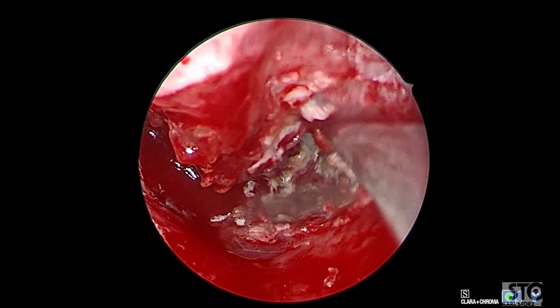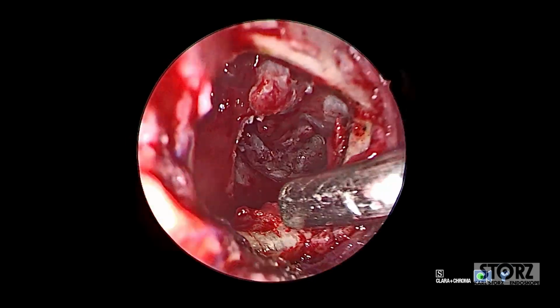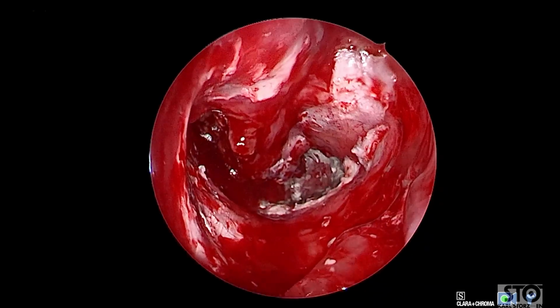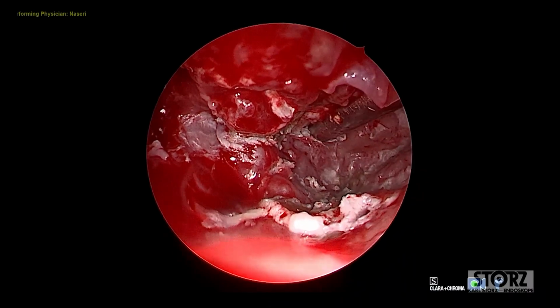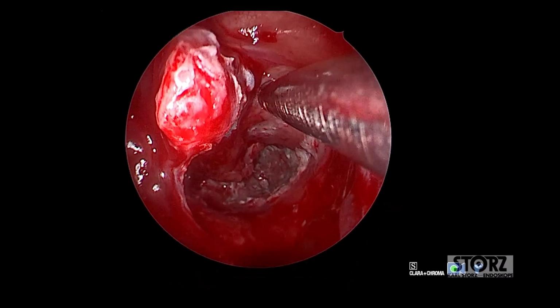With this modified brow incision and the osteotomy, it allows us to avoid use of a bifrontal bicoronal incision and allowed us to save approximately an hour of time. Total case duration was approximately an hour and a half.